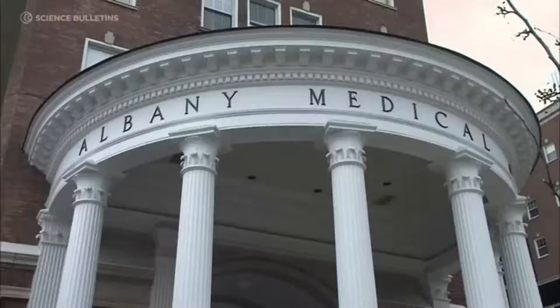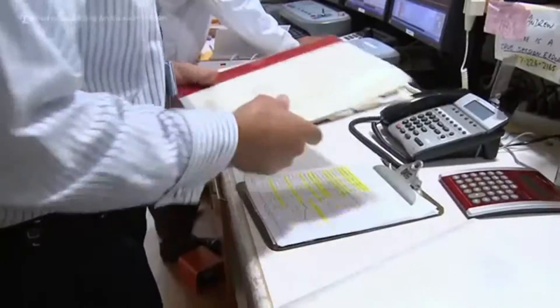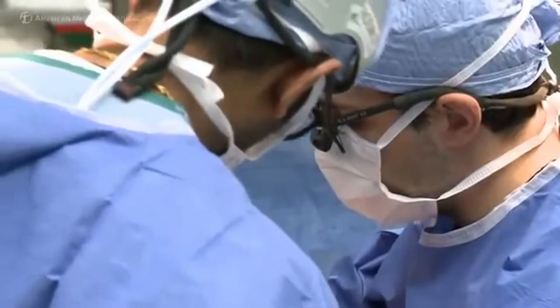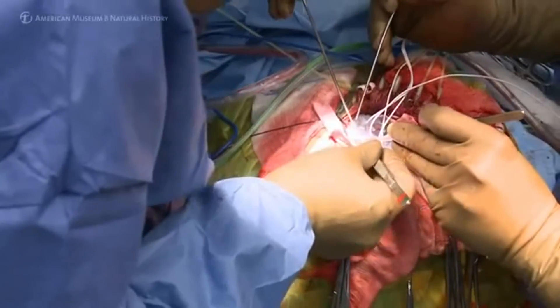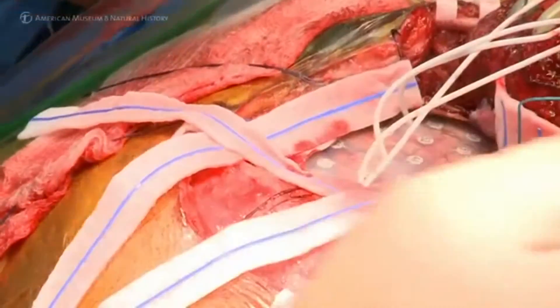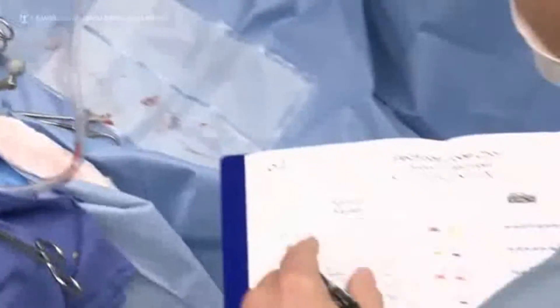You don't have that with ECoG. ECoG is our abbreviation for electrocorticography, which essentially means listening with an electrode or recording device directly on the surface of the brain. The people in whom we implant these devices represent a large number of people with seizures in whom medicines just don't work to prevent seizures. The only way we can understand the discrete location of where their seizures are coming from is by recording at the level of electrocorticography. And so while they're undergoing their other assessments, these patients allow us to essentially listen in for our research.